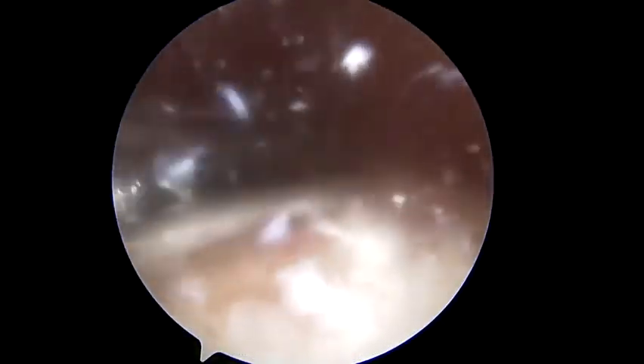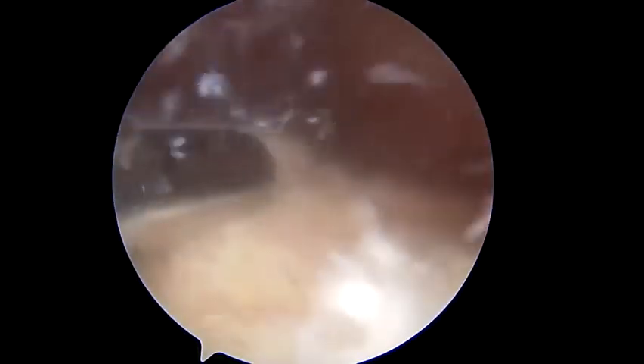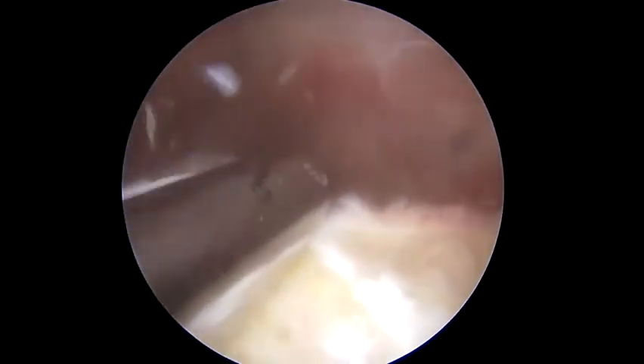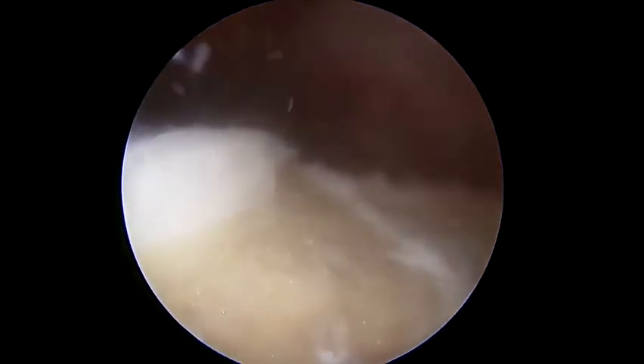Using different portals for viewing as well as fluoroscopic guidance helps ensure the resection is performed in a three-dimensional way that allows for a smooth transition for the patella. Resection of the bump alone is typically not adequate; the ramp created should be relatively shallow so that there is not a vertical wall left from the resection. Here we can see that smooth transition both in arthroscopy and on the final fluoroscopy, where it has been resected and there is a normal transition into the groove.